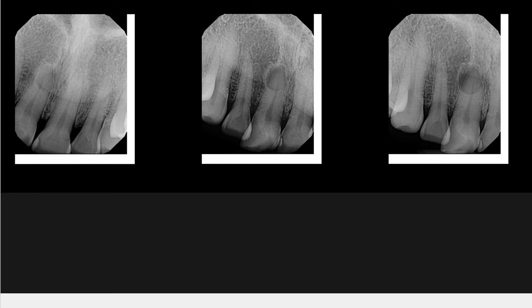We are currently seeing three periapical radiographs. The first two on the left were taken back in January of 2017. The one on the right was taken in March of 2019, just this month.